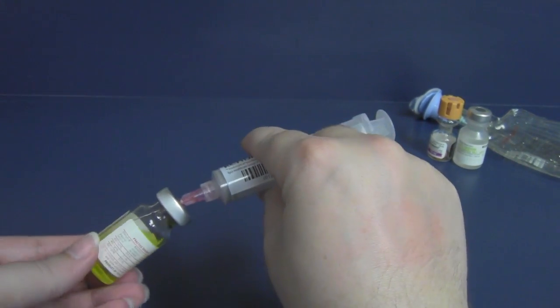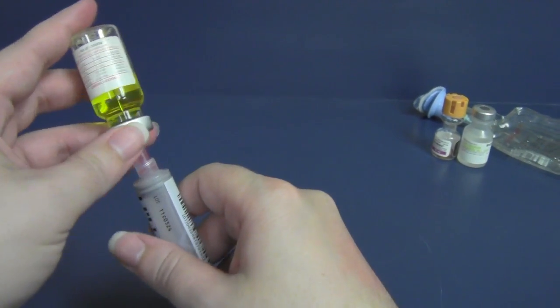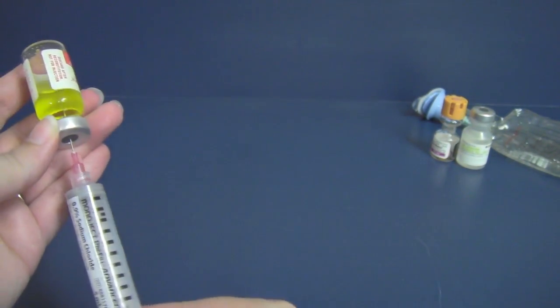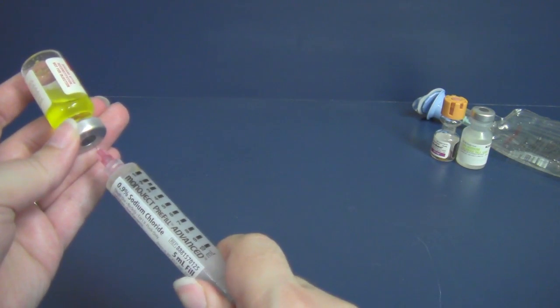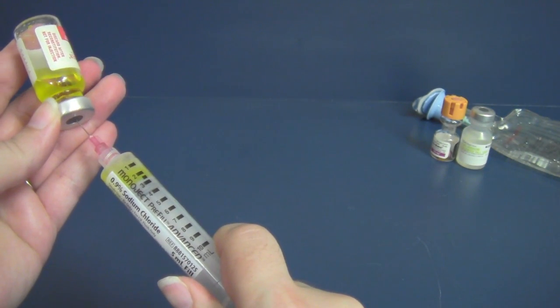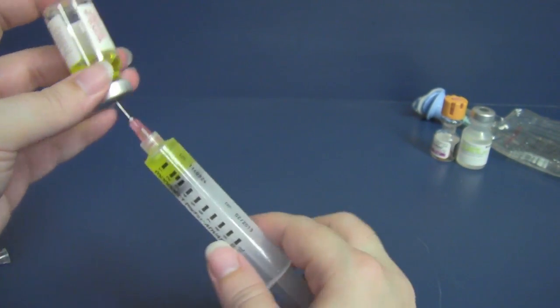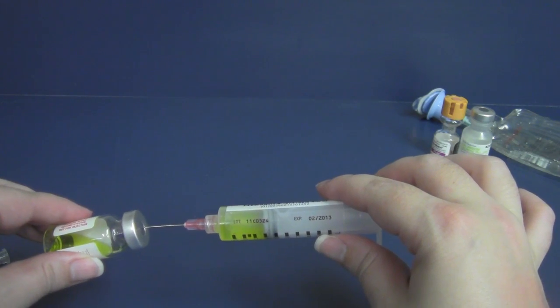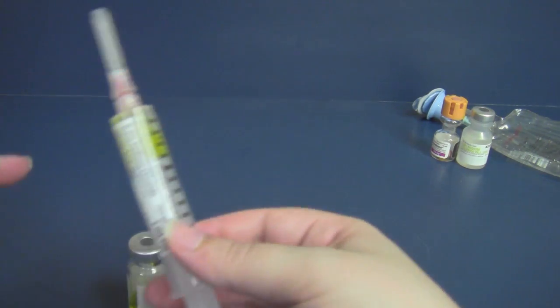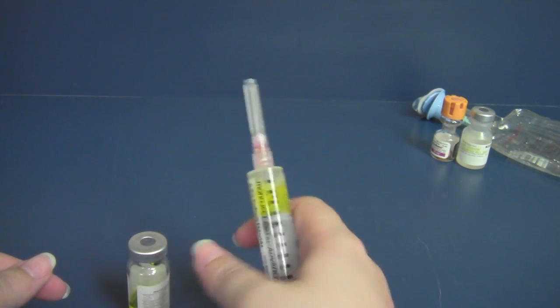Now I have a concentration of 500 milligrams per milliliter. If my patient only needed 1,000 milligrams, then I only need 2 milliliters, and I can go ahead and draw that up in my syringe, which won't use the entire volume of the vial. And I'll safely recap, and I'll label my syringe and be able to administer this to the patient.